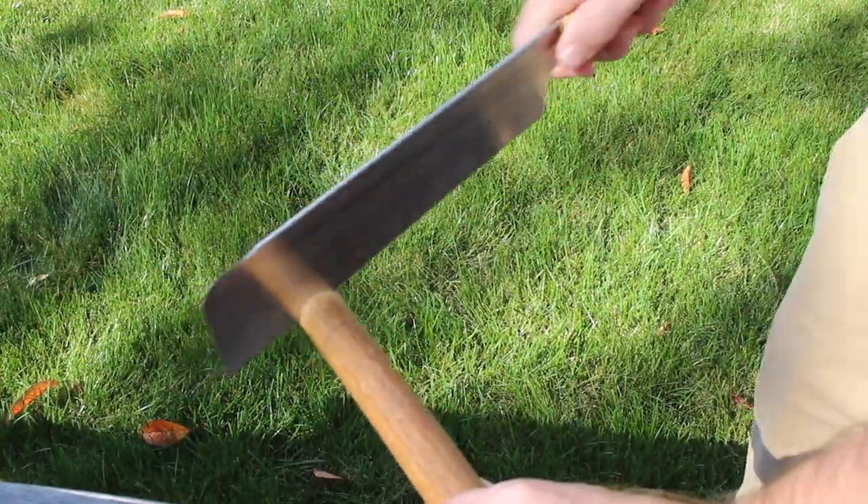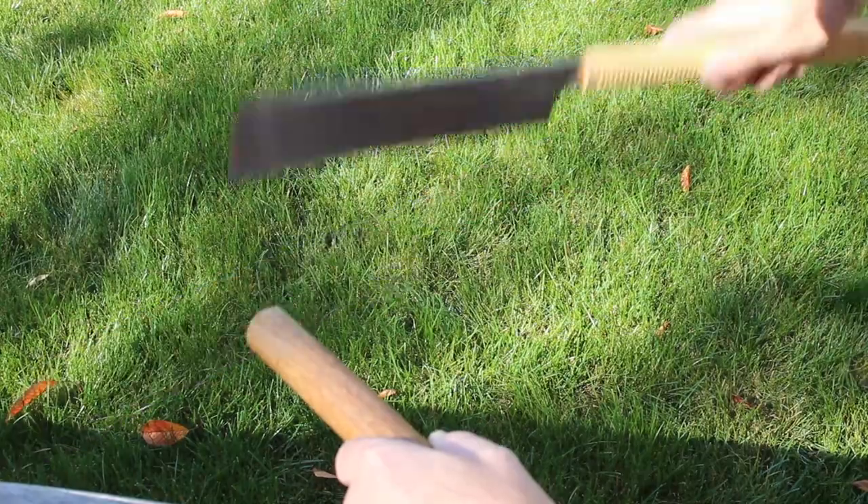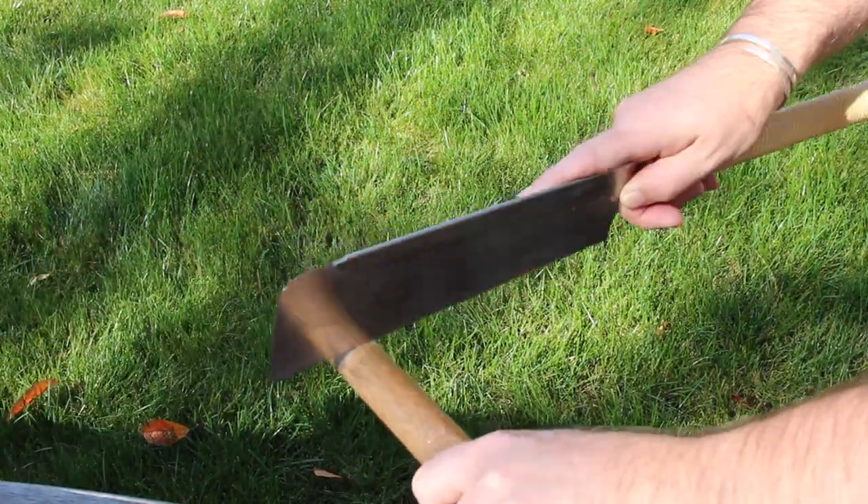After I cut off the end of the cane, I use the same saw to drop in an eighth-inch or so groove into the cane.